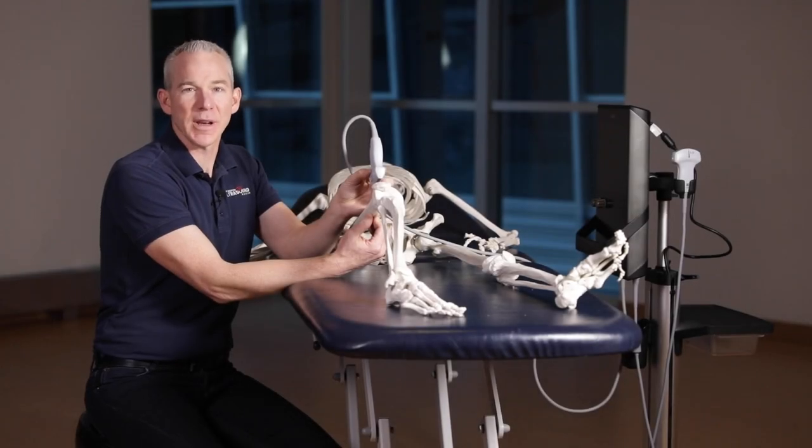Hi, Dr. Frank Johnson from Sport Medicine Ultrasound Canada. I'm going to show you how to scan the suprapatellar recess of the knee joint.